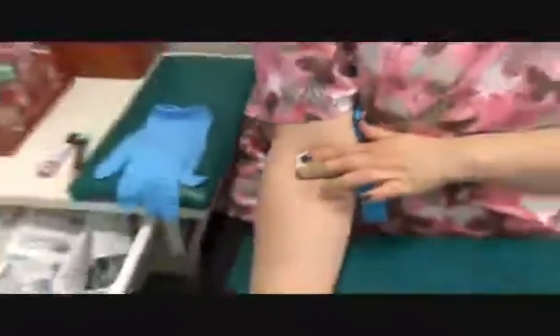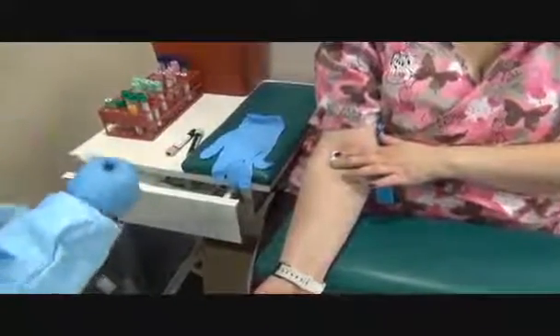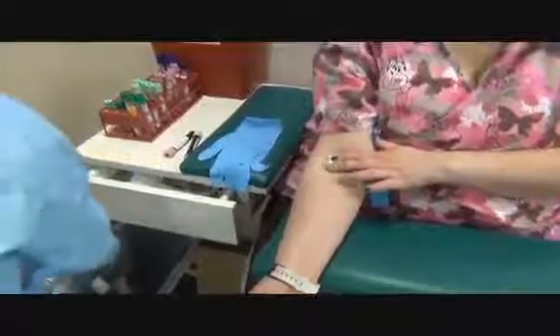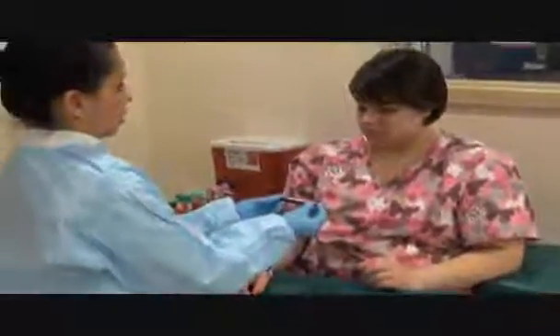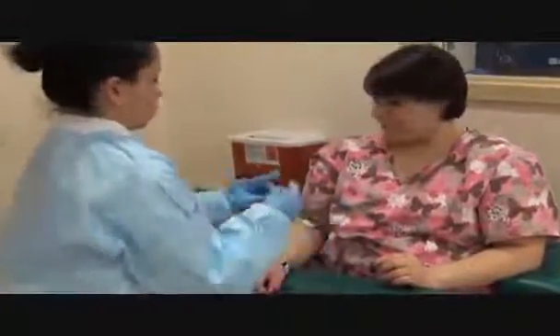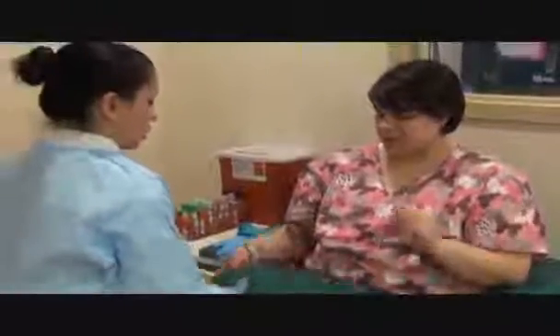Checking the patient's arm — are you on any blood thinners? No. Please apply pressure. Because the patient's not on any blood thinners, I'm going to use a bandage or tape depending on what the site has. Make sure you leave this bandage on for 15 to 20 minutes and no heavy lifting for the next two hours. Can you please verify that this is your name and date of birth? Yes, that's correct. You feeling okay? Yep. You're all done. Thank you, have a great day.